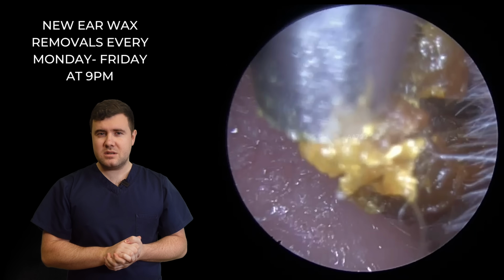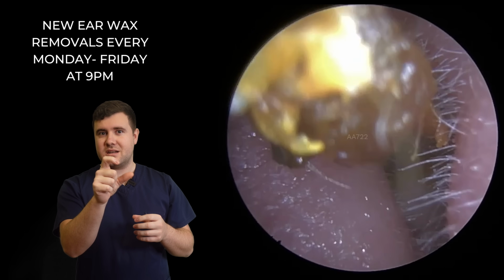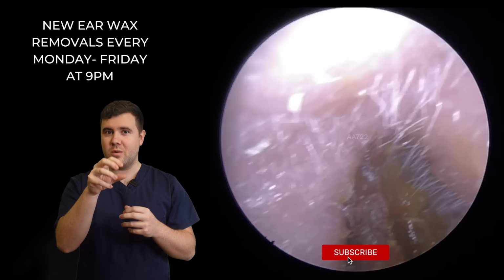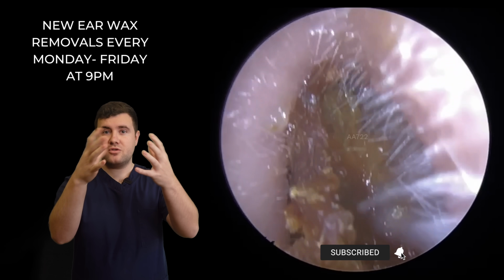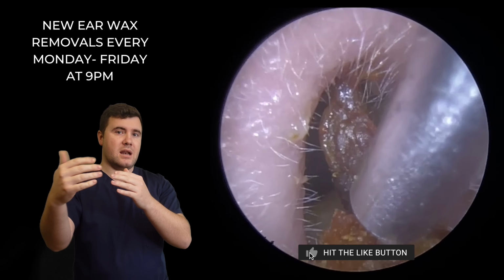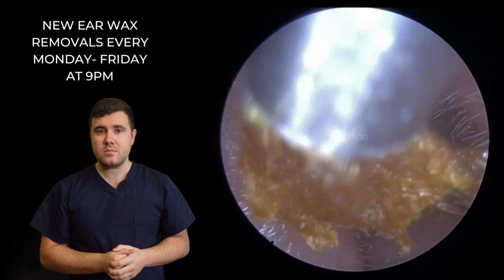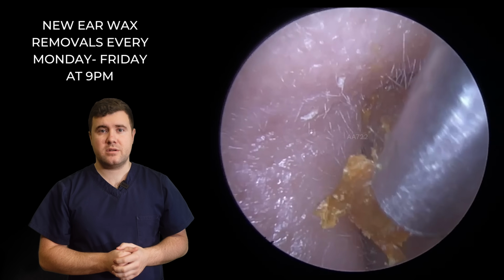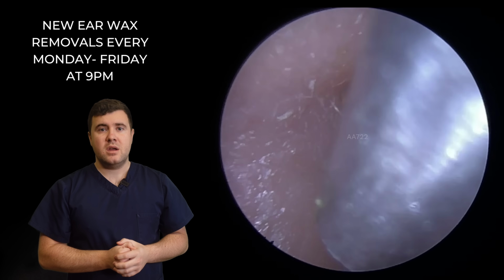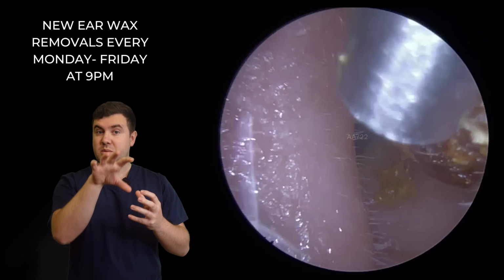So it was coming out easy, but it's just kind of got itself stuck. There we go. So you could just kind of see, just as that broke away, we've got this, again, dry skin, which is still attached somewhere deeper in the ear canal. And that's what was holding this, almost anchoring it in place. So we're sticking with the suction here. There we go, you can see it just going down the tube. So we're trying to get a good grip here and just gently wiggle this to peel this away.